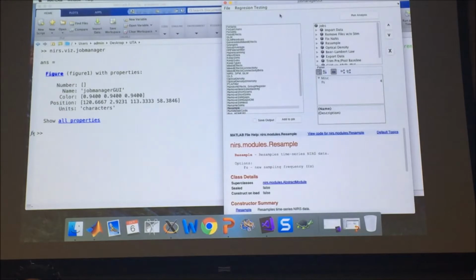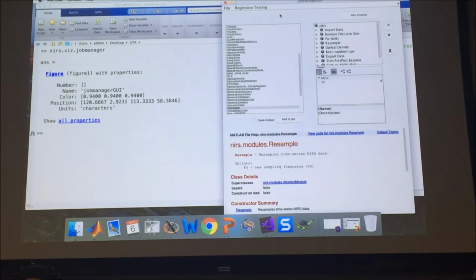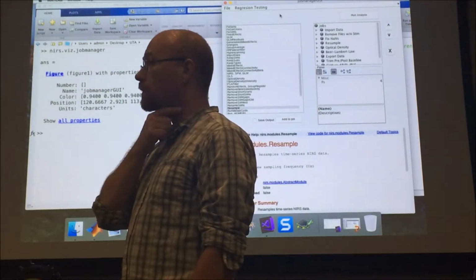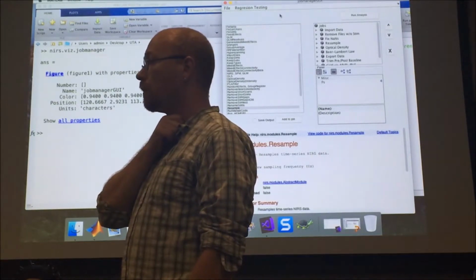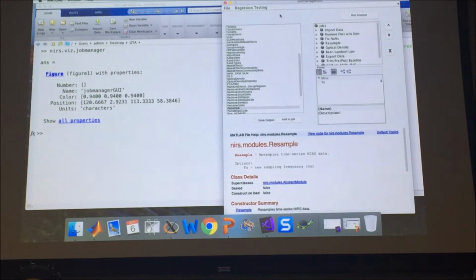Anyway, yeah. Could you please add another model that will automatically save all those tables and figures, precisely tables, in a text format? Yeah, I'll show how to save it into SPSS or Excel once you go through this. No, I'm actually suggesting that you also create another model that will save it into text format. Oh, into LaTeX format.